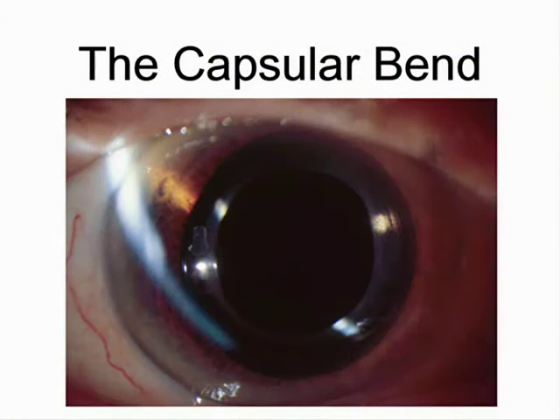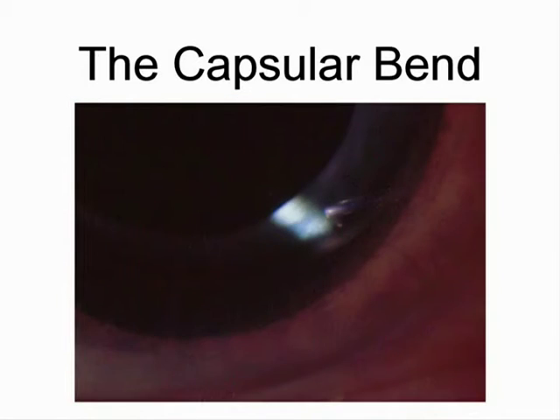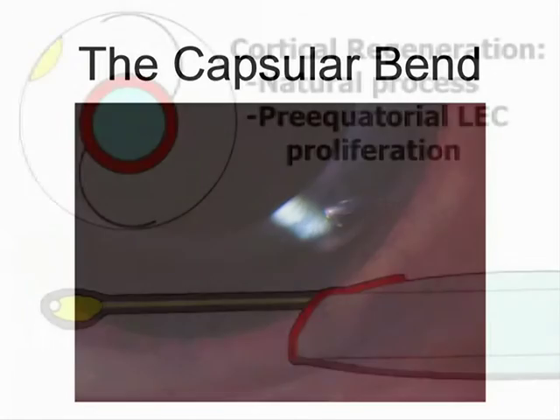This is a clinical example of the Sensar with OptiEdge, demonstrating an absolutely transparent posterior capsule. We see that the bend is clinically sound, extending from the anterior edge of the capsular rhexis all the way to the posterior edge of the optic.